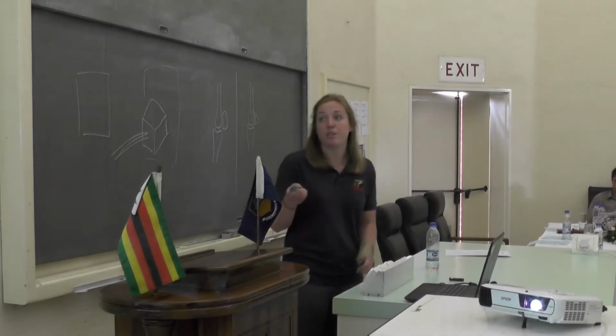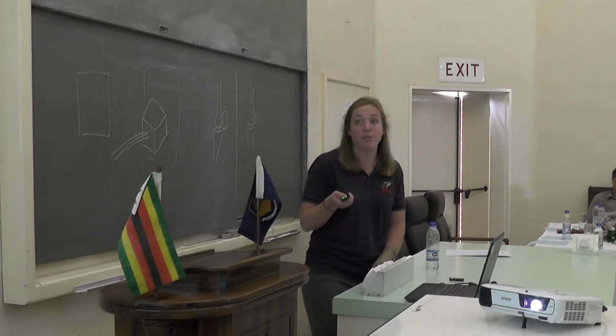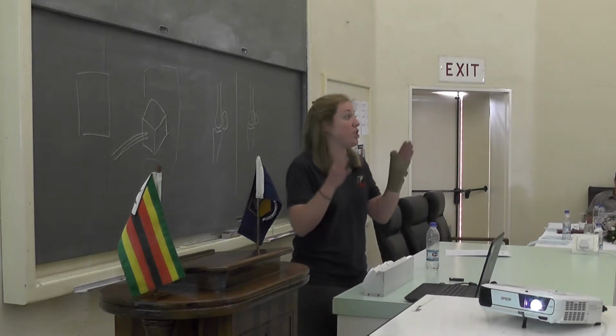If you think about this image, the rays are going this way, so the radiation is cutting the joint across this way. You can equally, if it's safer and more convenient to do so, put the cassette here and project from here, because ultimately that will still give you the same 2-dimensional plane.